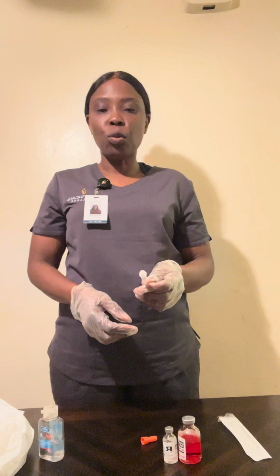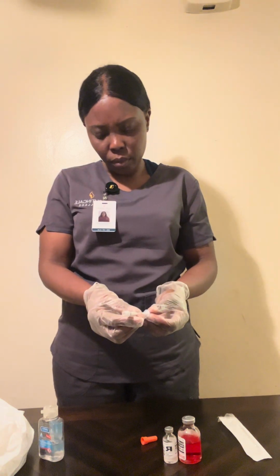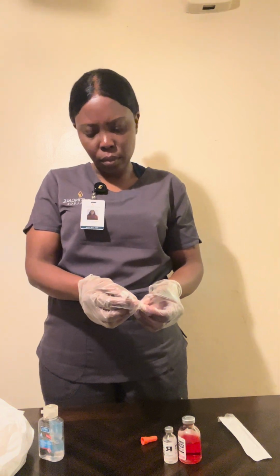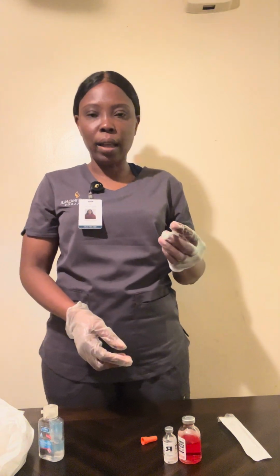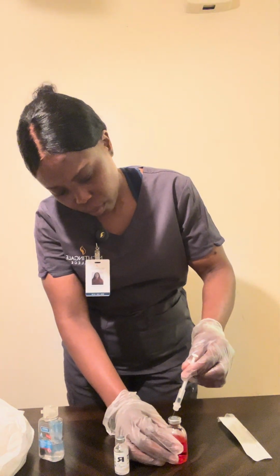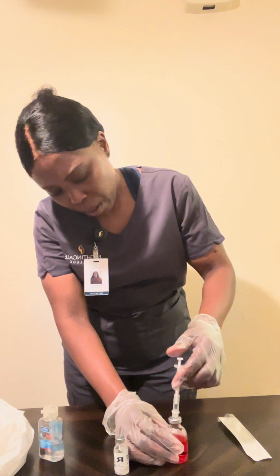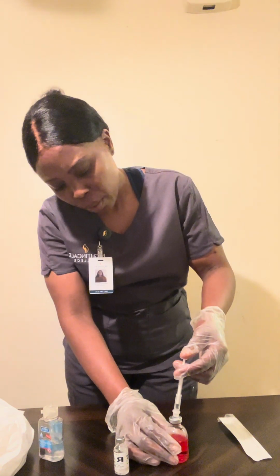Now I'm going to withdraw 8 units of air, and inject that into the NPH vial, making sure the needle does not touch the medication.